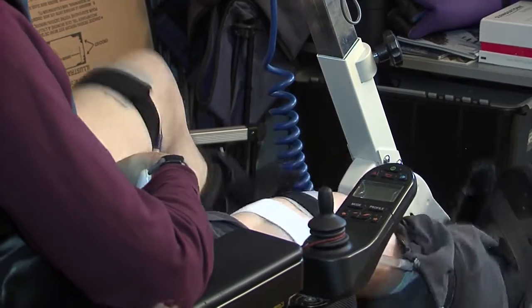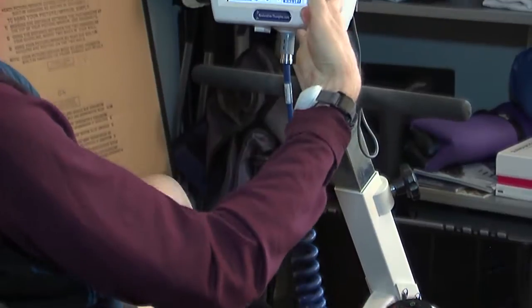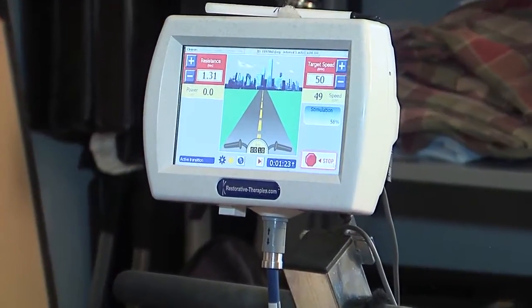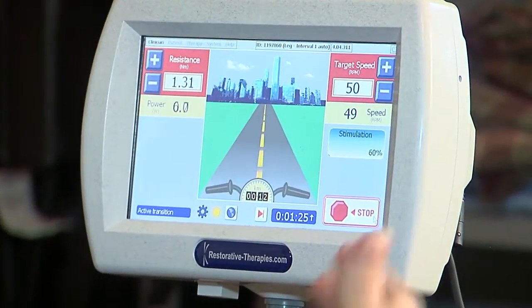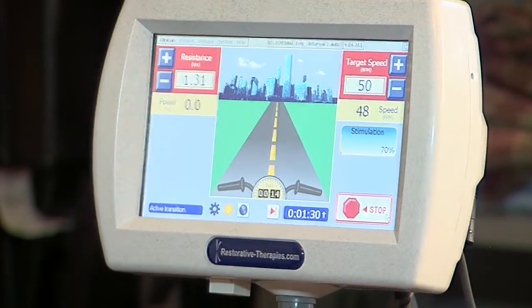The stimulation will gradually increase. What the machine will do is increase the stimulation until my legs are moving at the target RPM against the specified level of resistance.